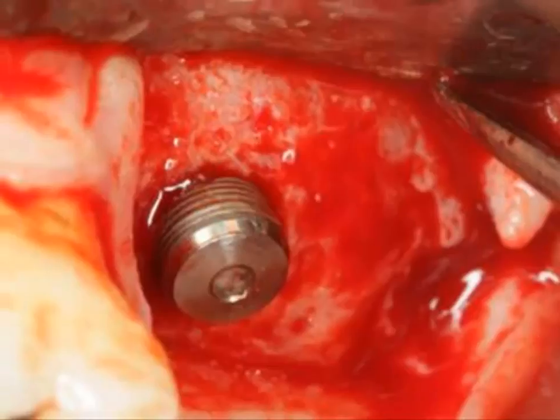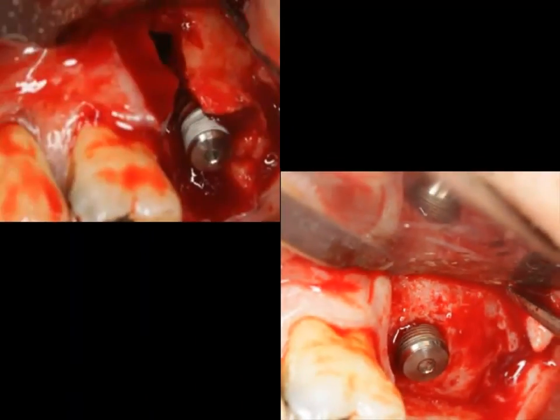The bone is built only in regions where bone support is available. Thus, bone would not be built above the crest. Notice that although covered by BONDBOND, bone was not built above the implant's head, which was left exposed intentionally during augmentation.